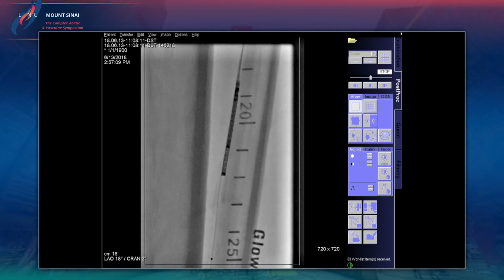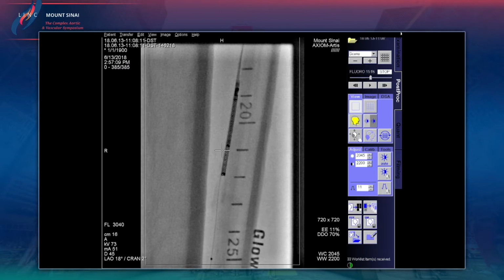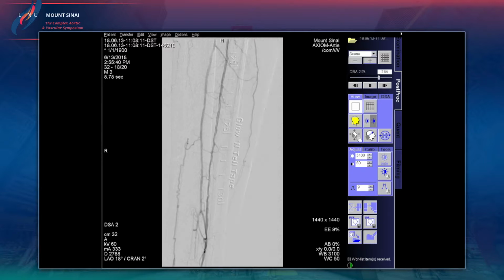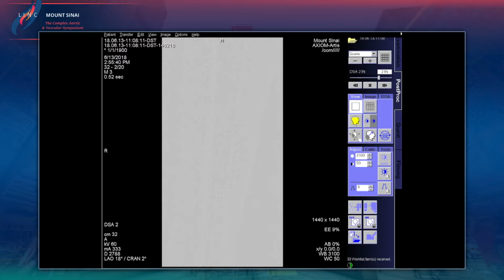I want to ask Brian this question. Brian, when you cut these diffuse lesions, and I can tell you I'm kind of nervous here because of the look of that artery, do you cut in any one direction? Do you pick? I just want to show you the last picture. So you see here from 20 to 30, you can see the lesion right there. It's multiple, lumpy, bumpy, but clearly it's significant along with the others.